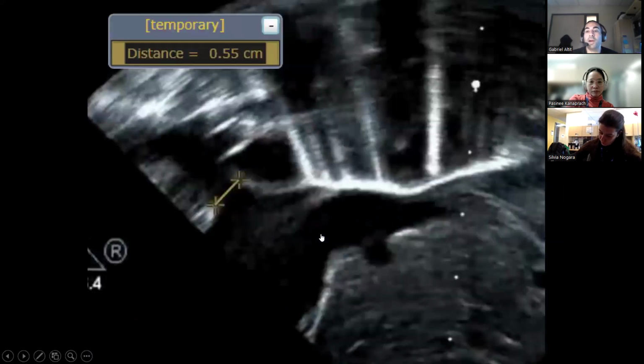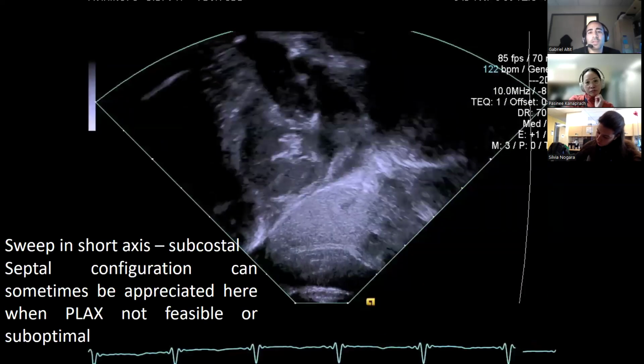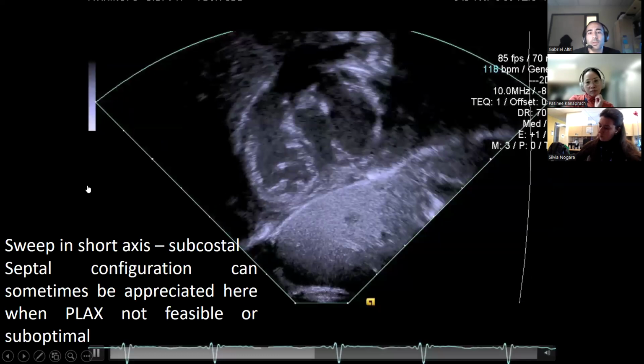So in BPD pulmonary hypertension, for example, if we're concerned about pulmonary hypertension, it's somewhere that we're going to want to go and Doppler. If you're not concerned about hypertension, the RV looks beautiful, it's slim, the TR is normal, you have a full curve, it's not necessary to go and Doppler because we're more focused. So same thing in short axis, we can do a sweep.